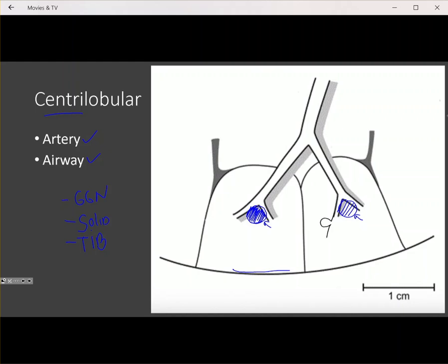Another type of centrilobular nodule is the tree-in-bud opacity. A tree-in-bud opacity represents an impacted very distal terminal airway with some sort of debris — either aspirated contents, pus or exudate, or some sort of cellular material — giving a branching opacity. These branching opacities on CT are called tree-in-bud because they look like the branch of a tree with small buds coming off of it. So centrilobular nodules are evenly spaced, spare the pleural edges, and can be solid, ground glass, or have a tree-in-bud configuration related to impacted terminal airways.